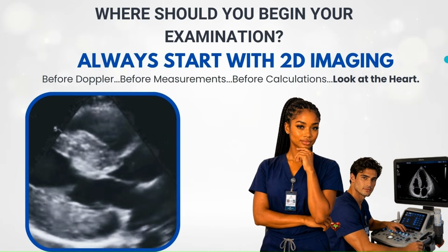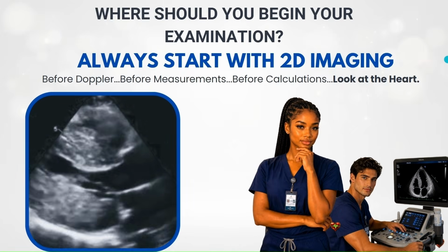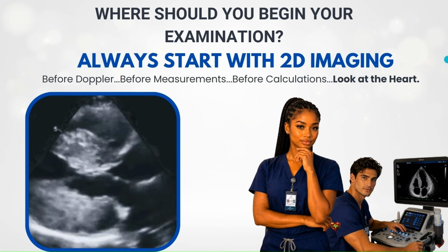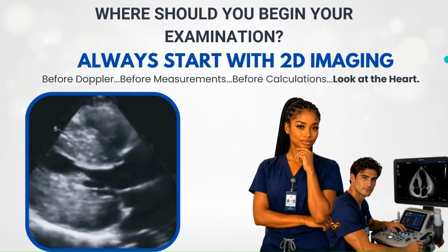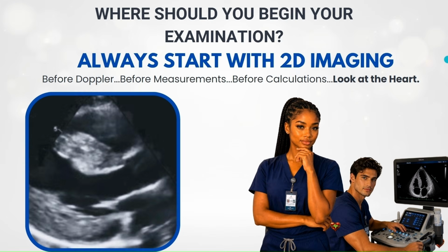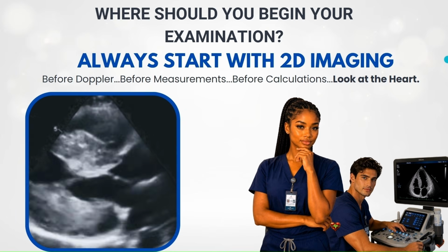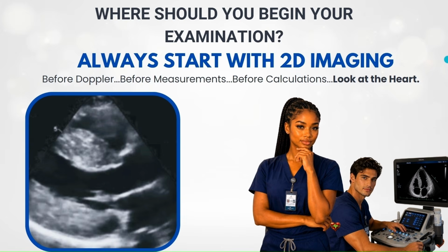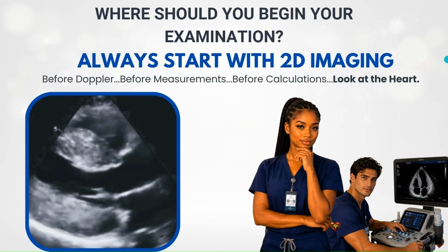Does the ventricle look hyperdynamic? Does anything immediately make you suspicious for HCM? This first impression often determines how you perform the rest of the examination. The heart usually tells you where to look. You just have to slow down long enough to see it. Now that we have observed the heart, what should we evaluate first?